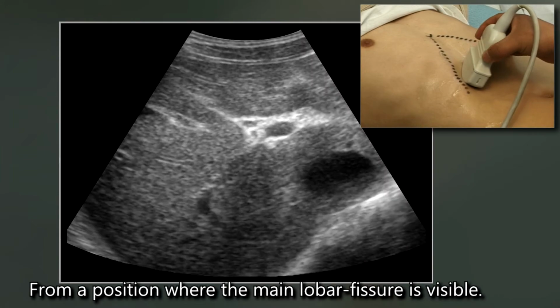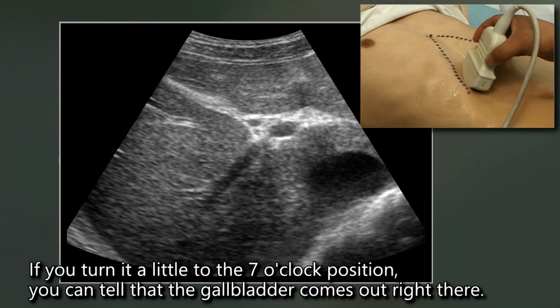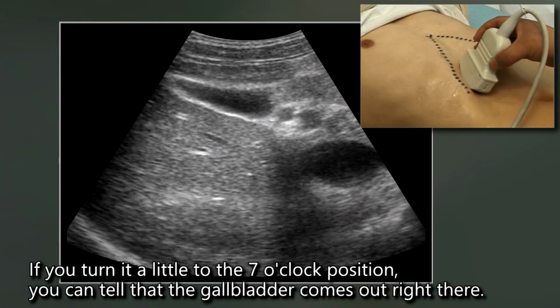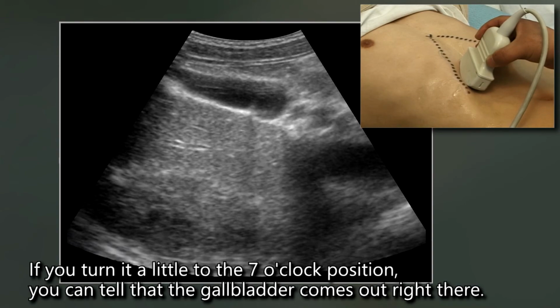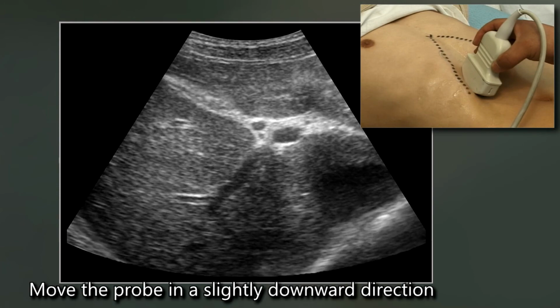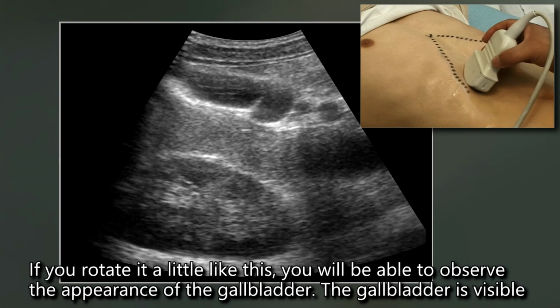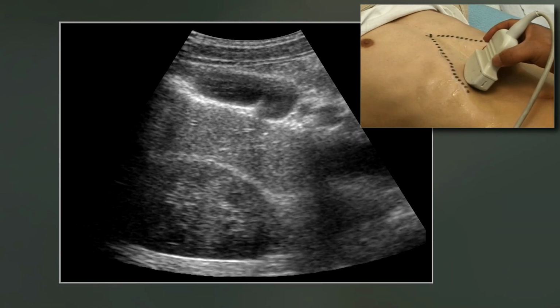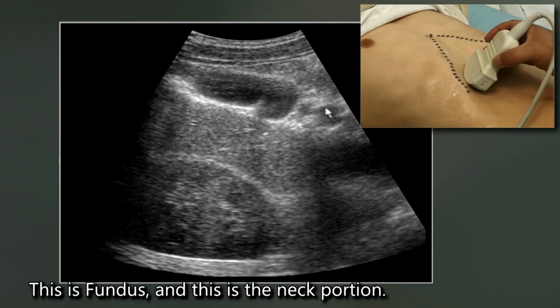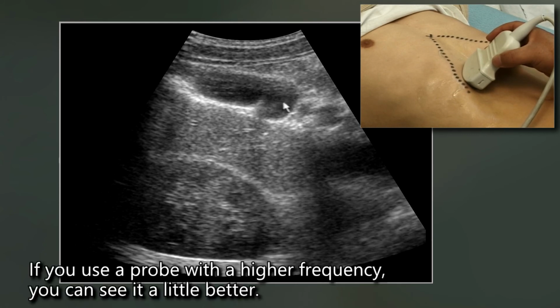From a position where the main lobar fissure is visible, orient the probe slightly downwards. If you turn it a little to the 7 o'clock position, you can tell that the gallbladder comes out right there. So when the main lobar fissure starts to show, move the probe in a slightly downward direction. If you rotate it a little like this, you will be able to observe the appearance of the gallbladder. The gallbladder is visible. This is the fundus, and this is the neck portion. Because the gallbladder is located very close to the abdominal wall, if you use a probe with a higher frequency, you can see it a little better.